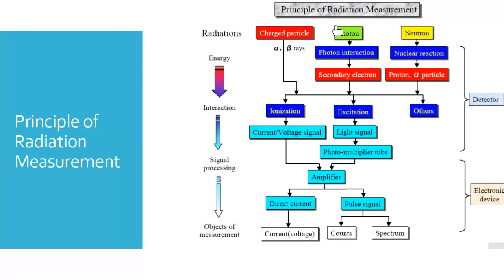As I said before, in order to detect radiation, we have to search for a specific material that gives us a specific effect. For this presentation, I will not speak about alpha or beta rays. We will just speak about photons. We can detect photons either directly or indirectly. Directly by producing direct electrical charge from gas detectors or semiconductor detectors.